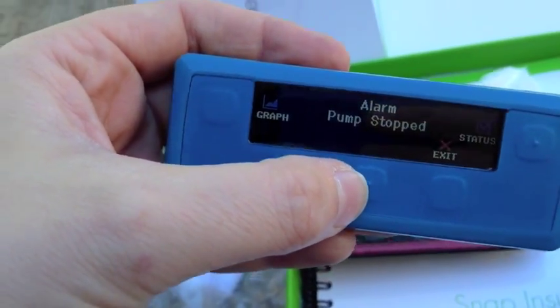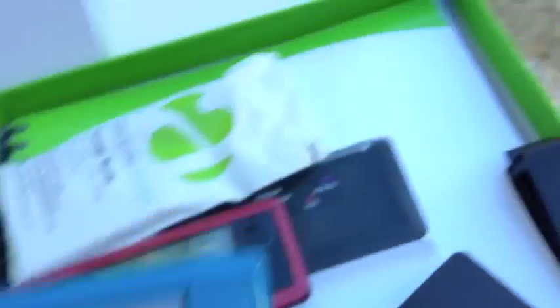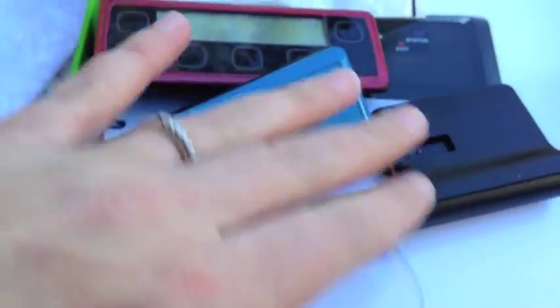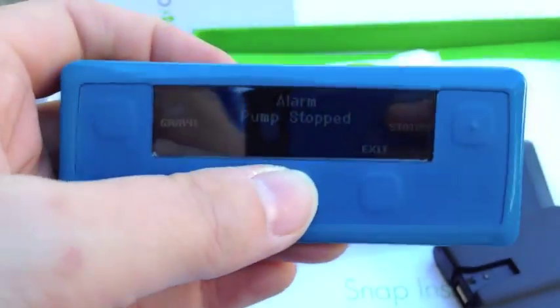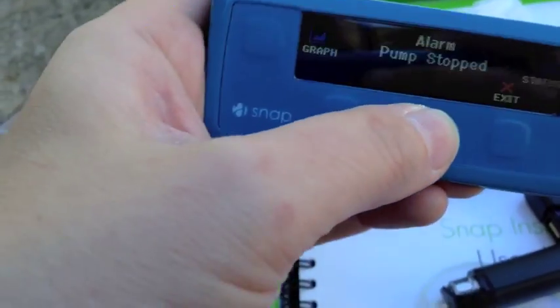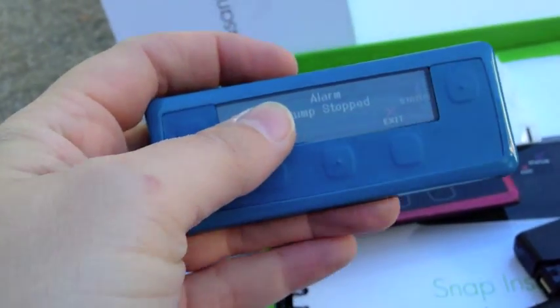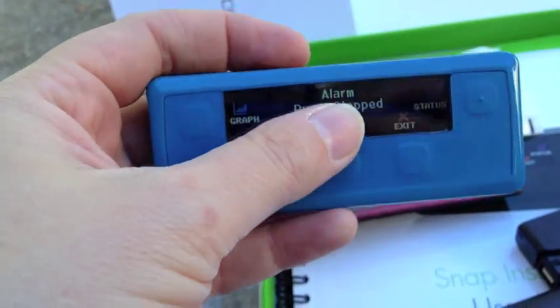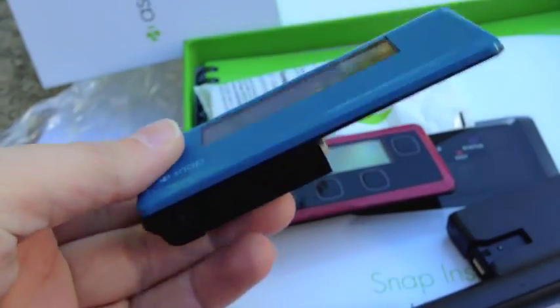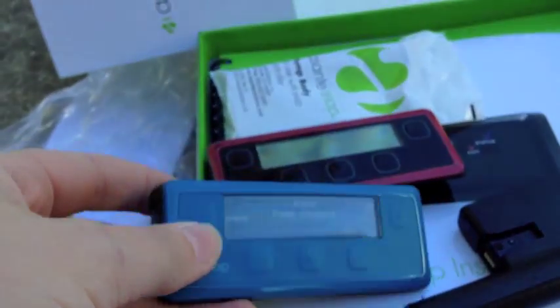I'm out here in the daylight now. To program the pump, I literally just had to snap on my current pump body to the new controller and then I was prompted — it said, do you want to use the settings from the pump body? And I said yes. So already all of my user settings from my original snap are already loaded. I didn't have to do anything in the setup menu at all.